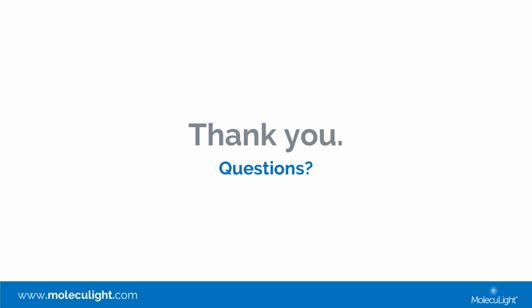Okay, we do have a couple of questions about the long-term care setting. Someone writes that they do not have a physician in-house, but they have two who come for rounds each week. Would the facility still be able to bill for the procedure if a WOCN or RN nurse would be the one using the MolecuLight? Leah, could you comment on the long-term care setting? Sure. Certainly the regulatory Medicare guidelines for what can be billed in a long-term care setting versus a skilled nursing facility will prevail. However, these codes are not in any way part of consolidated billing.